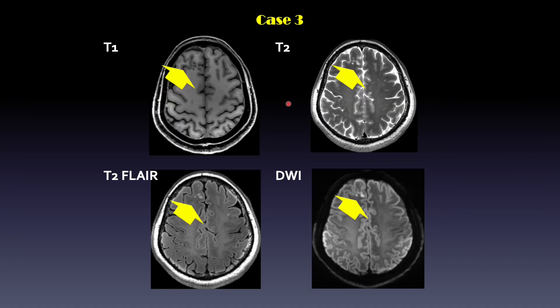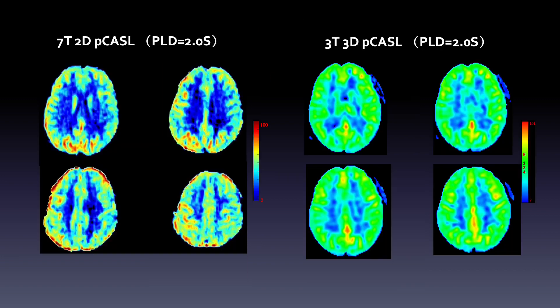Case 3 is a 55-year-old woman with probable dysembryoplastic neuroepithelial tumor. There is a nodular lesion in the right frontal region. The patient underwent ASL at both 3T and 7T. In this case, both field strengths showed hypoperfusion. However, at 7T you can see better delineation of the white matter and gray matter boundary, as well as the hypoperfusion lesion, which improved diagnostic confidence.